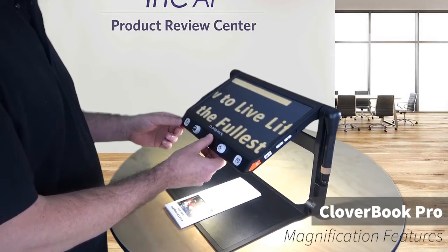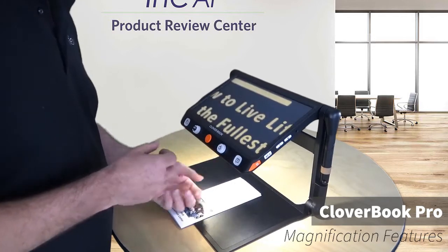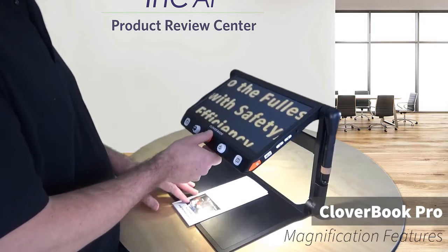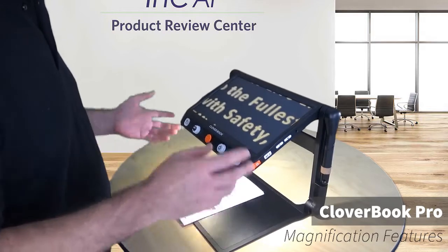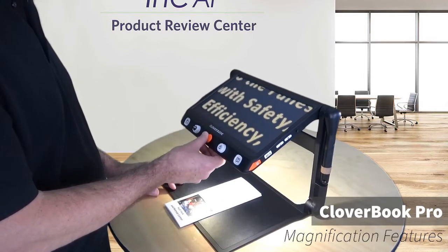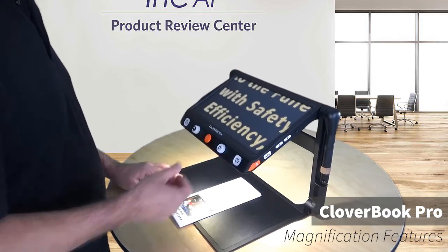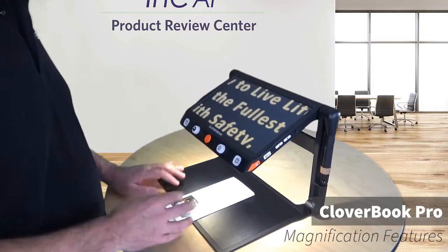So most often you may use this for a prescription bottle or something you're holding underneath there, and you can just move around and use it. Or if you just want to go down a column more easily and not keep moving reading material or try to move the device, it's a real convenient way to see everything using this handy dandy little joystick in the middle. So that's kind of the basic magnification uses.